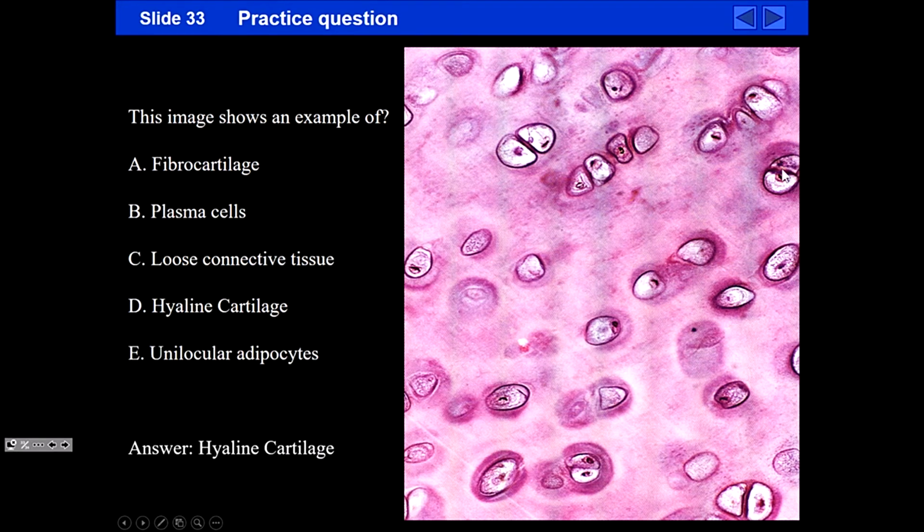Yeah, this is a forming isogenic nest. These two cells together, it looks like a forming isogenic nest down here. See, these two cells look like one of them gave rise to the other, all right? So yes, we could say this is an isogenic nest. There are much better examples of isogenic nests where you might have 4 or 5 cells together. But yeah, like this, that's an isogenic nest, and it looks like it's got a ring of something stained around it differently. Other questions?